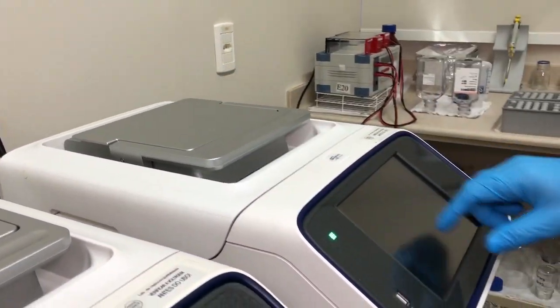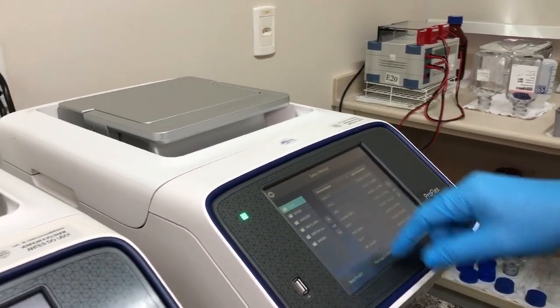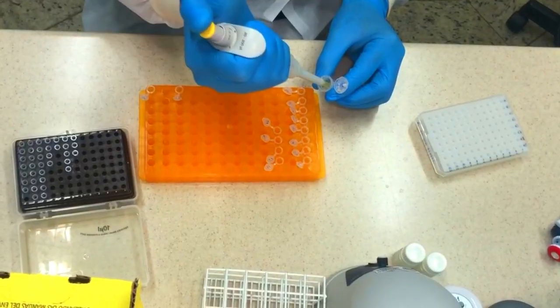Amplification takes about two hours and 45 minutes in a thermal cycler — this is the longest step in the protocol. After that, it will take only about one hour to finish the protocol and one more hour to sequence the sample.